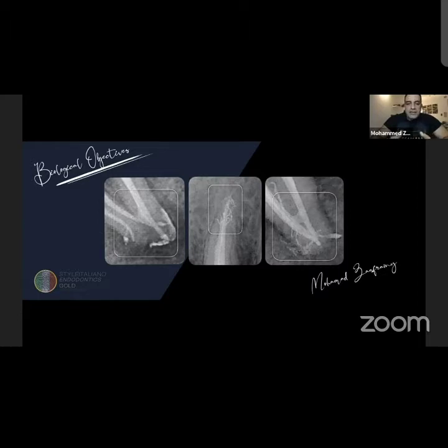And we all know that the root canal system is so complex. It is not just the shape we are making with our files. No, we have anastomoses, we have lateral canals, and the complexity of the root canal system needs instrumentation of the canal to allow our irrigant to reach these areas, to clean and disinfect them from microorganisms that may be responsible in future for biological failure.